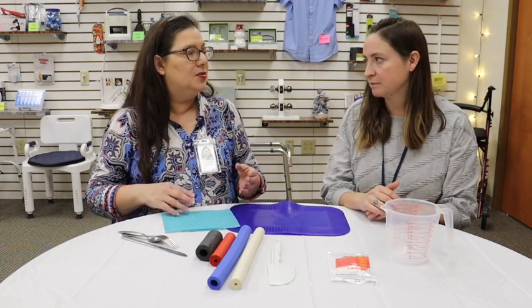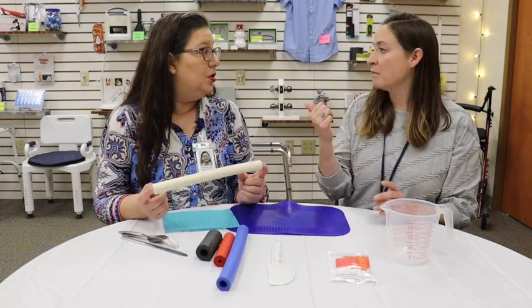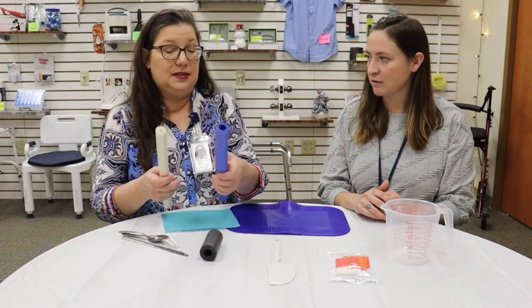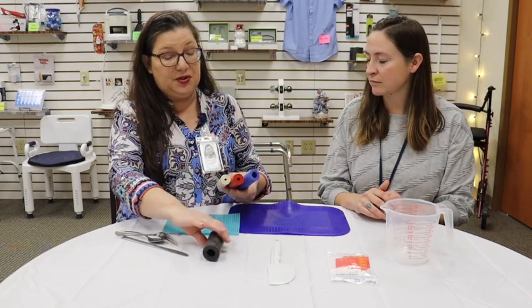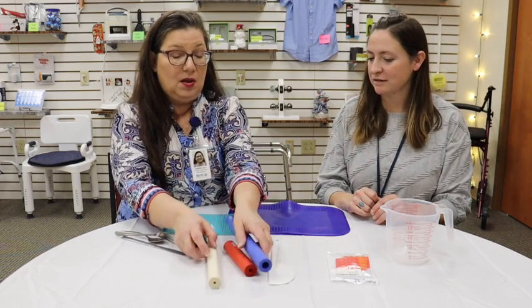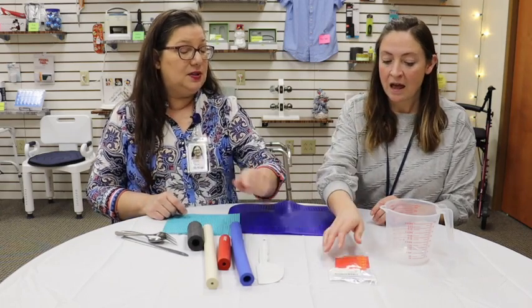There's a lot of little sleeves and things you can do. Even some of these sleeves can go on the handles of your measuring cups. Again, all of these are different diameters. We've talked about earlier how they go on silverware, but they're different diameters for different things. You can put them on the handles of your dry measuring cups, as well as your knives and things like that.